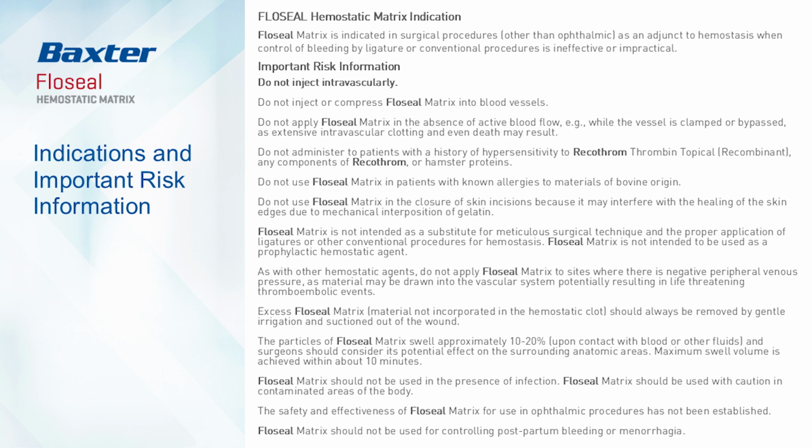Do not administer to patients with a history of hypersensitivity to Recothrom thrombin topical, recombinant, any components of Recothrom, or hamster proteins. Do not use FLOSEAL matrix in patients with known allergies to materials of bovine origin. Do not use FLOSEAL matrix in the closure of skin incisions because it may interfere with the healing of the skin edges due to mechanical interposition of gelatin.